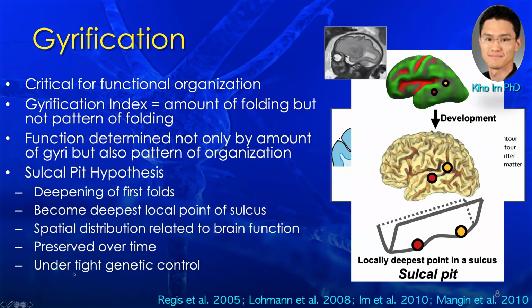These are the surfaces that were reconstructed from these fetuses. These are currently not available for qualitative assessments during clinical reads, but you can see that the cingulate sulcus is atypical in the fetus on the bottom, and the central sulcus here has not started to appear. This fetus was born with normal gyral topology and had a normal outcome, whereas this fetus developed diffuse polymicrogyria, and you can see these cysts as well too.